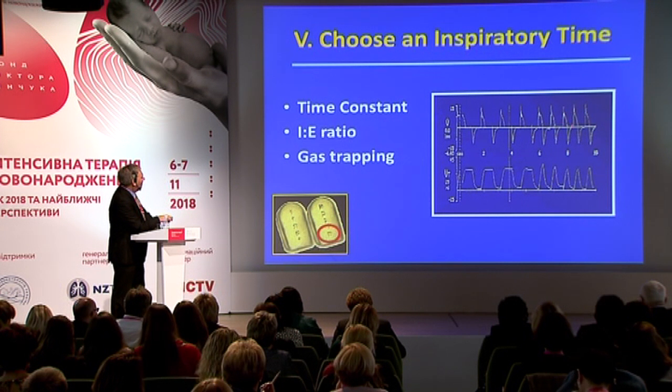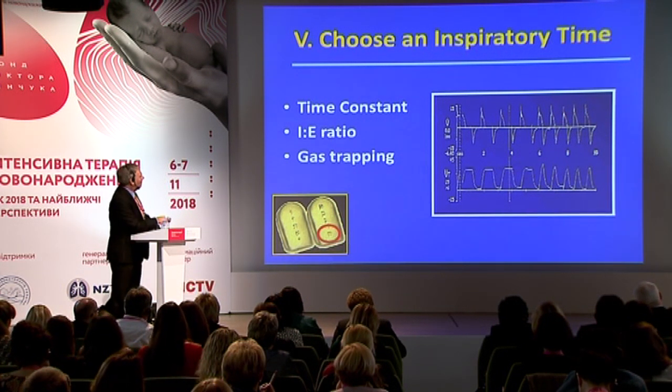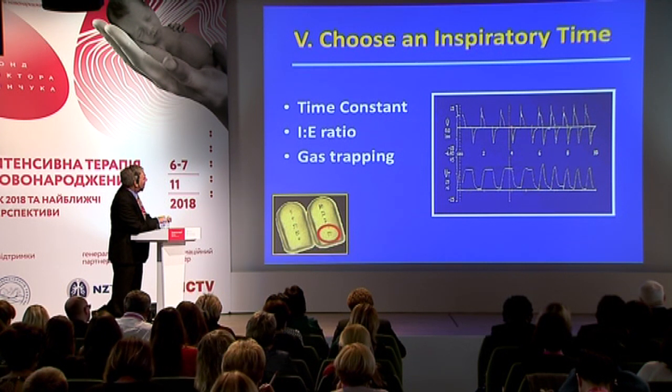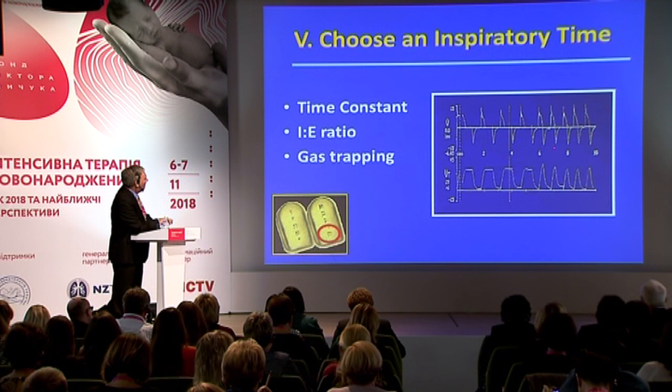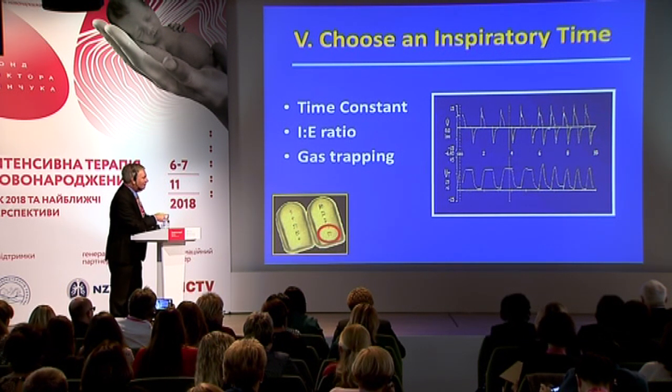And over here, the last 4 or 5 breaths, we've switched to flow cycling. And you can see how it changes the contour of the flow waveform. Here, instead of having this prolonged zero flow state, we cycle directly into expiration when we reach the termination point. And that leaves us with a much more physiologic delivery of tidal volume.